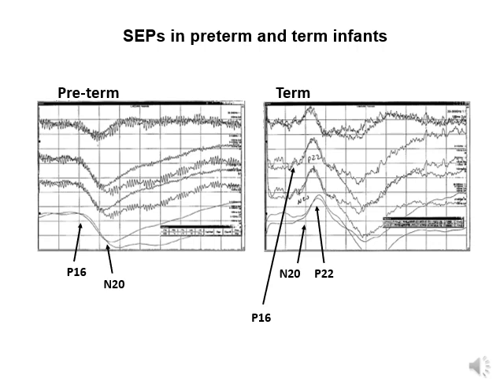Moving to the development of the cortical components. Not all of the cortical components of the SEP are observable in neonates. The peaks within the SEP are not as well delineated due to poor myelination and poor signal summation and conduction to the surface of the scalp for recording.